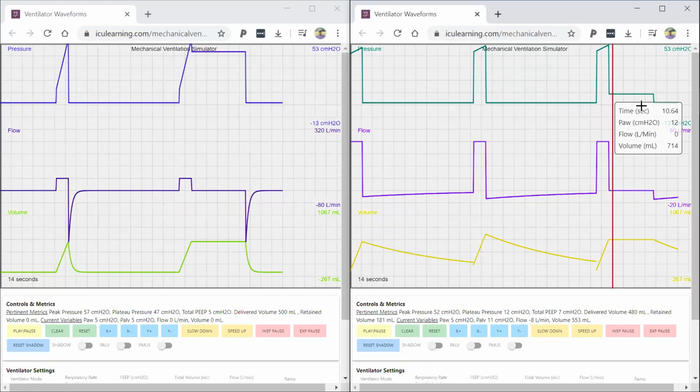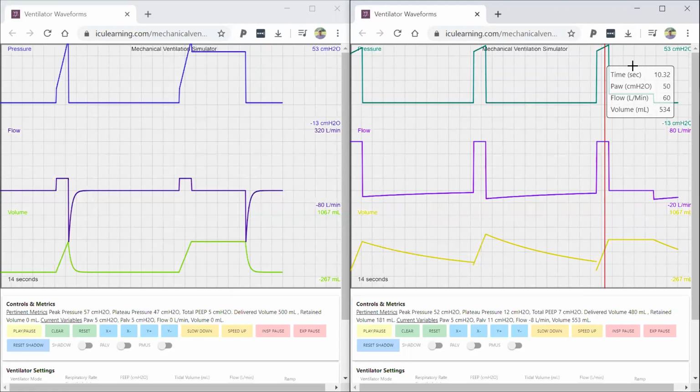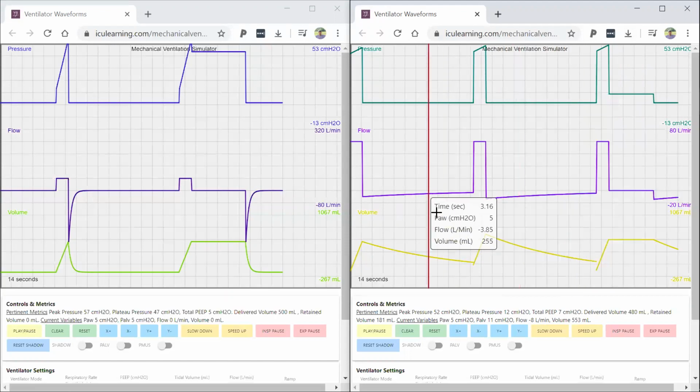So that's quite normal. That tells you that the increased airway pressure in the 50s has to do with increased resistance, or very tight airways. And again, remember that the second case here is a case for a patient with an asthma exacerbation.